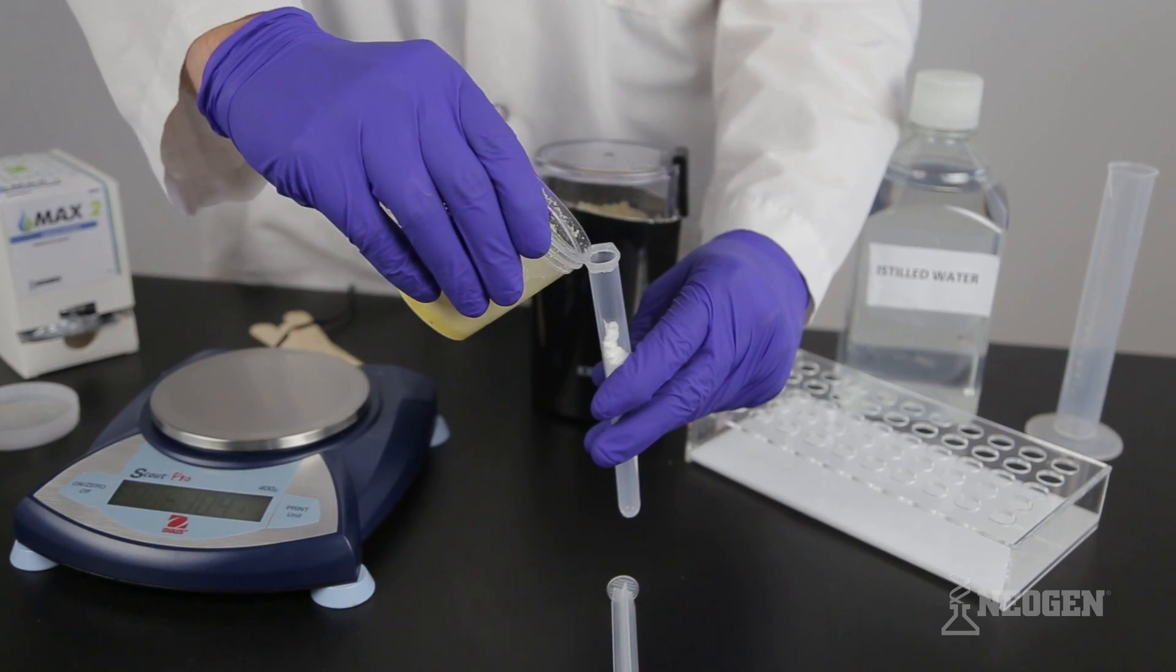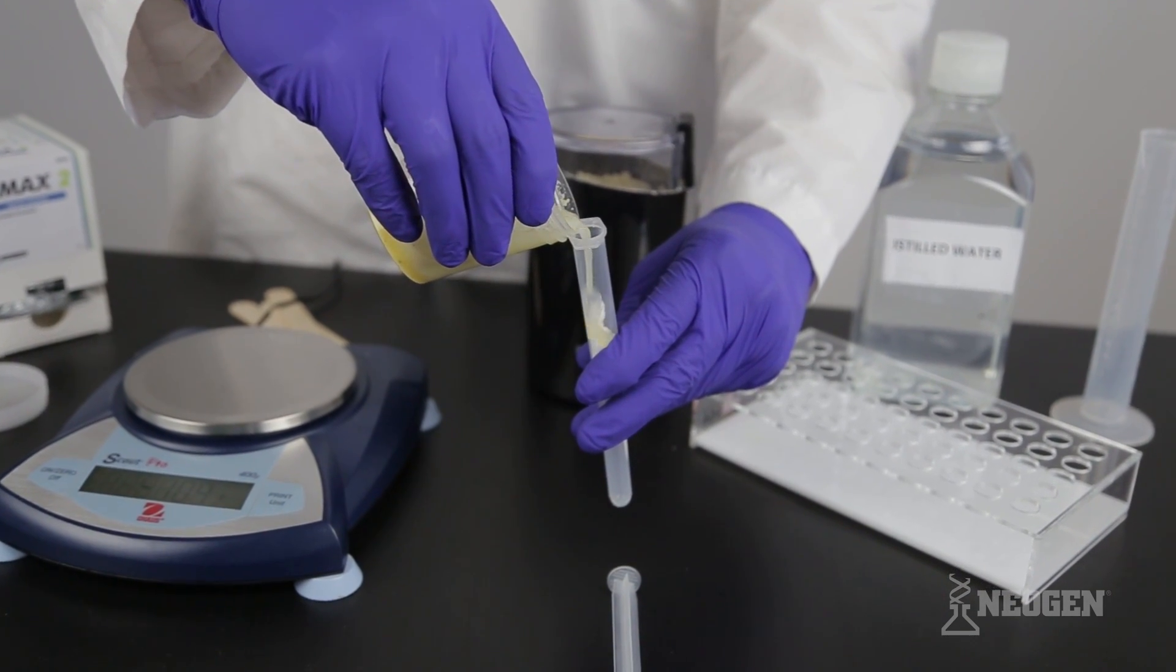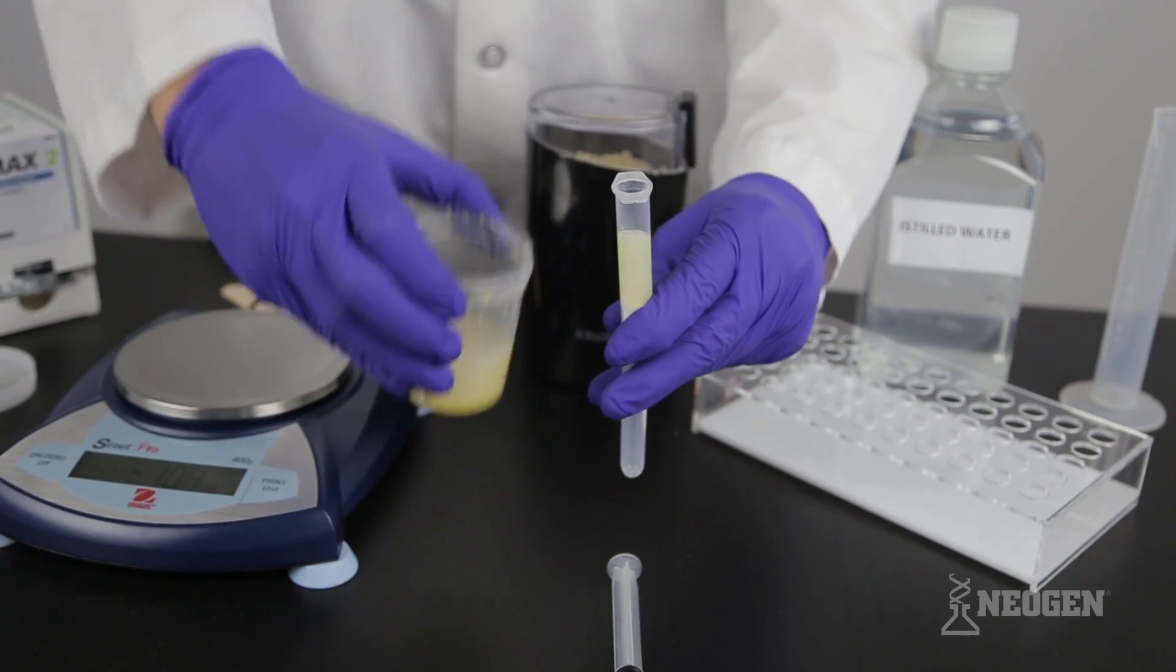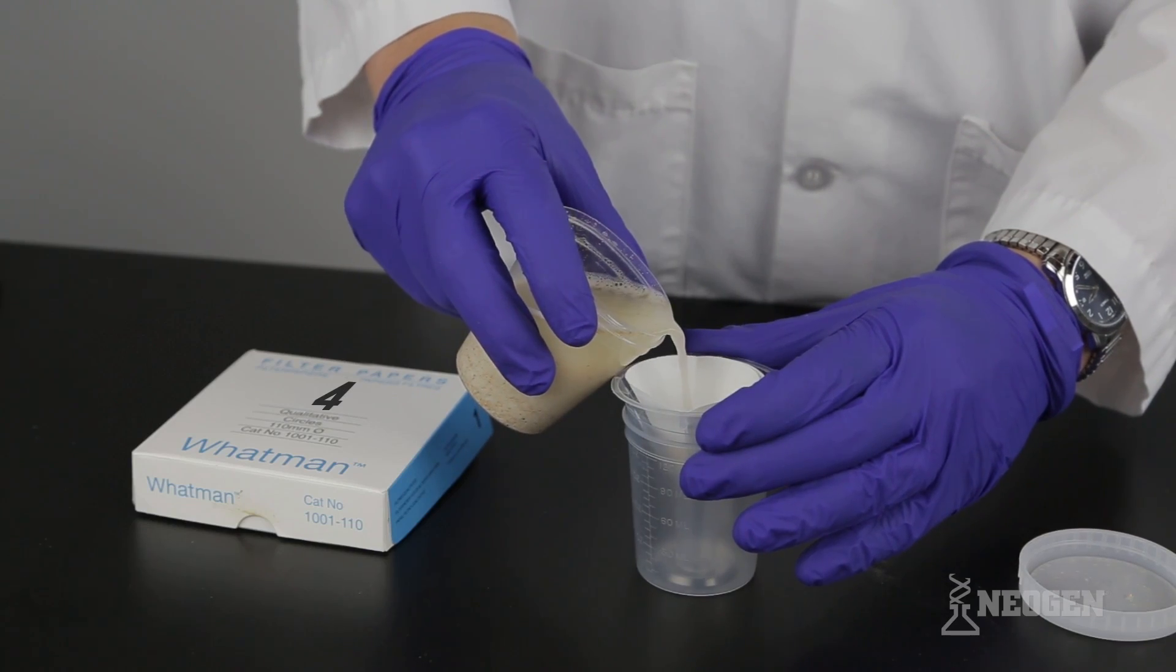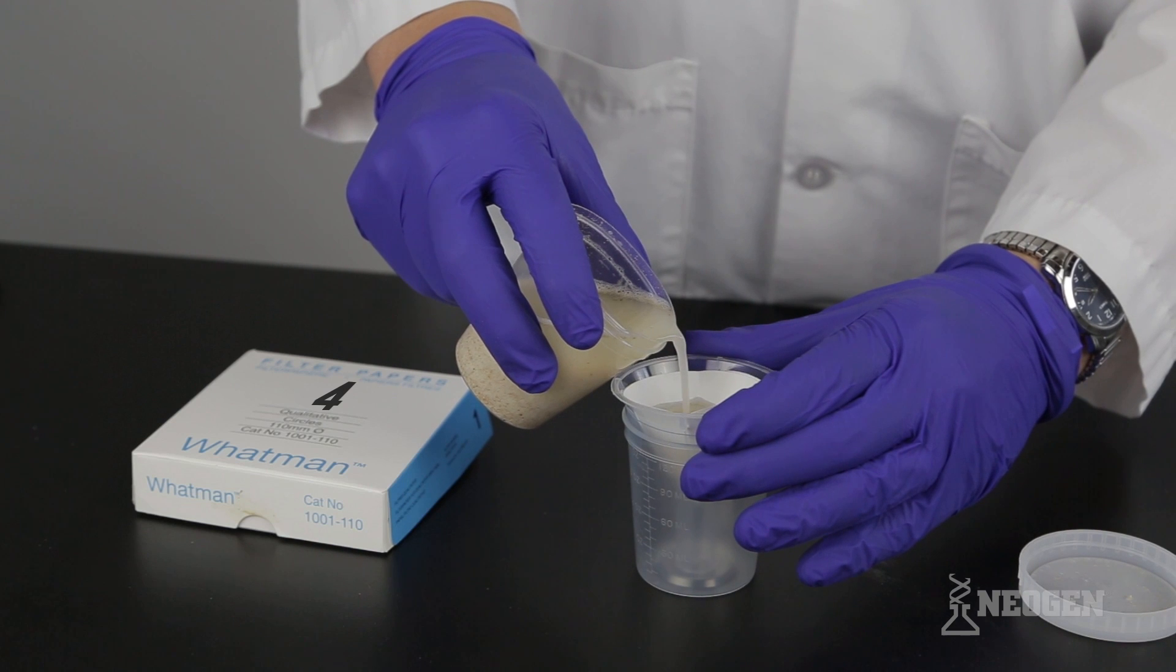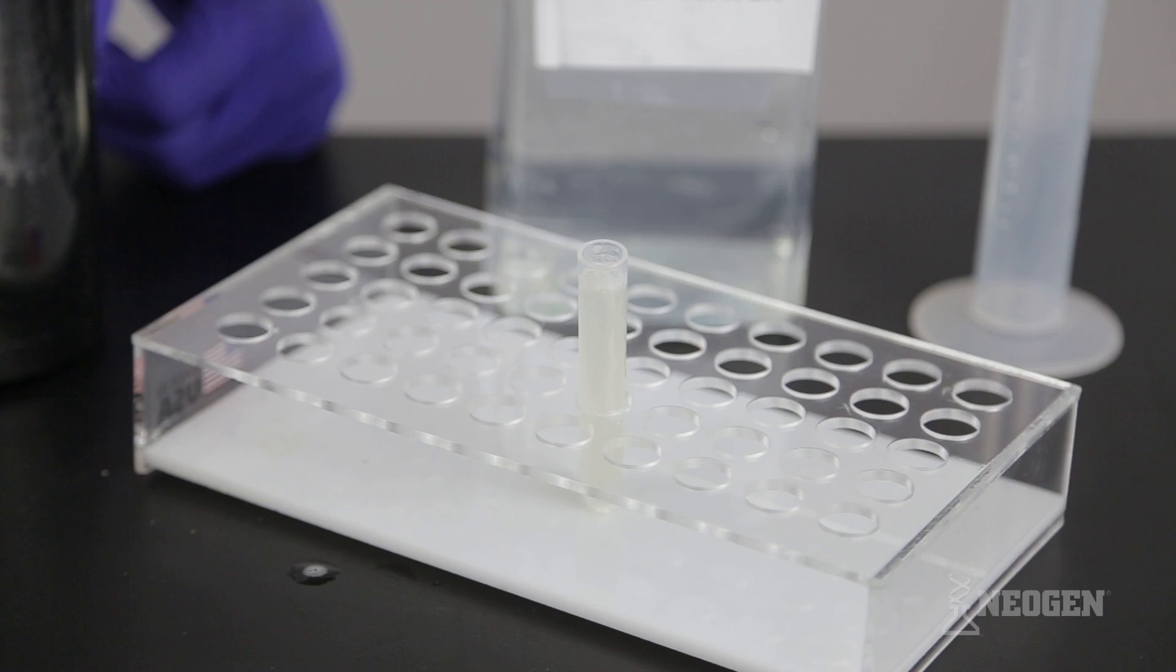Filter the extract by pouring at least 4 milliliters through a filter syringe, collecting the filtrate in a sample collection tube. You can also filter using Whatman number 4 filter paper. Your sample is now ready for testing.